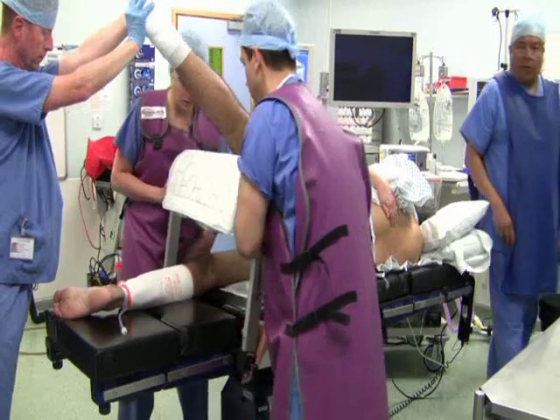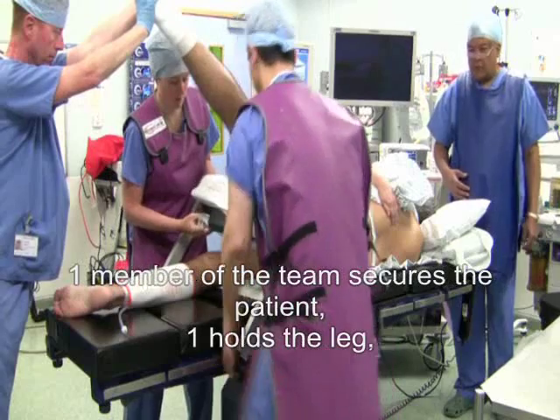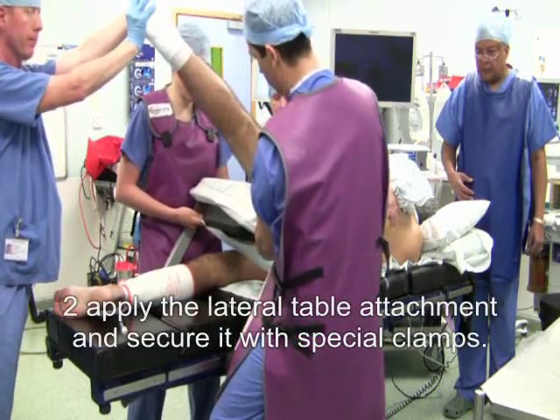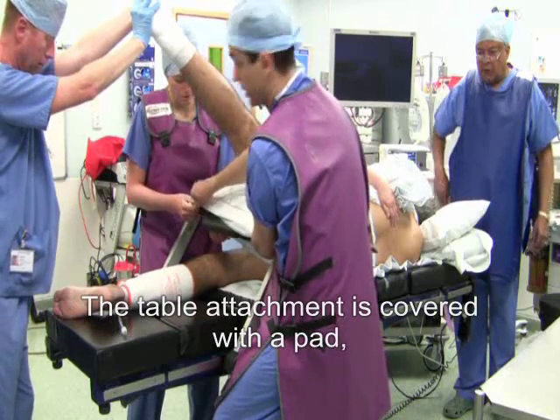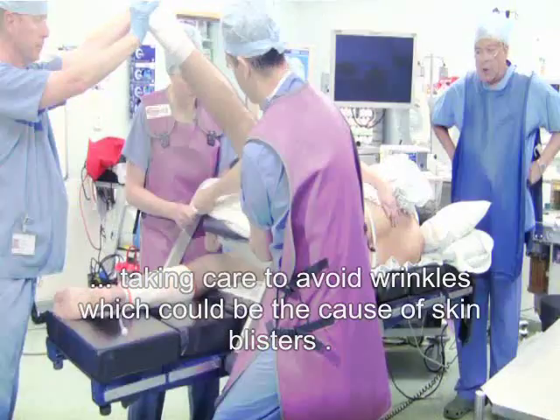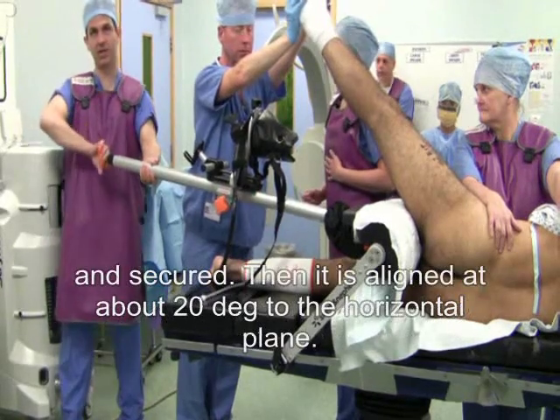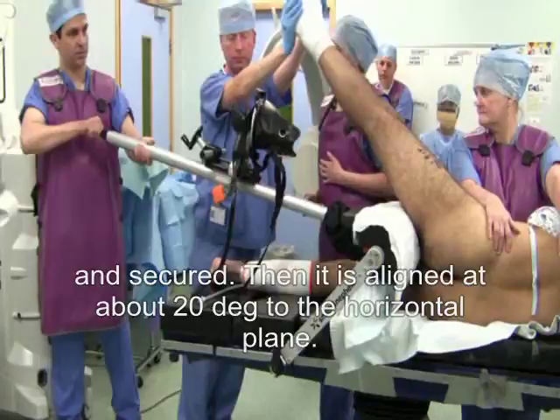The patient is positioned on the operating table in the lateral position. One member of the team secures the patient onto the table, one holds the leg, and two apply the lateral table attachment and secure it with its special clamps. The table attachment is covered with a pad, taking care to avoid wrinkles which could cause skin blisters. The hip distractor is assembled with the lateral table attachment and secured, then aligned at about 20 degrees to the horizontal plane.